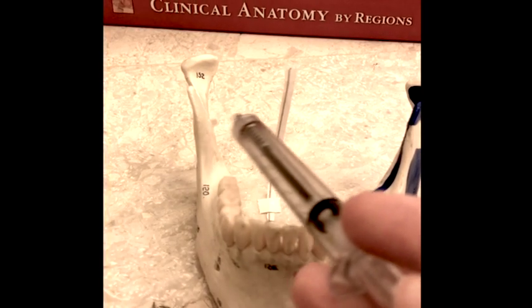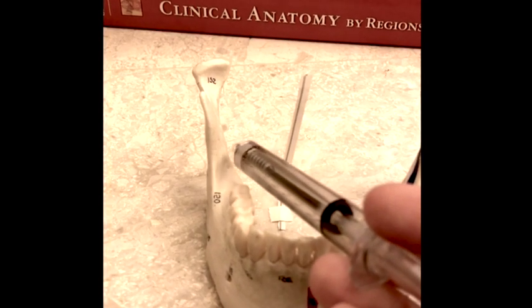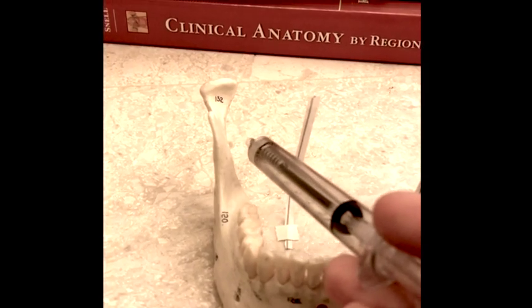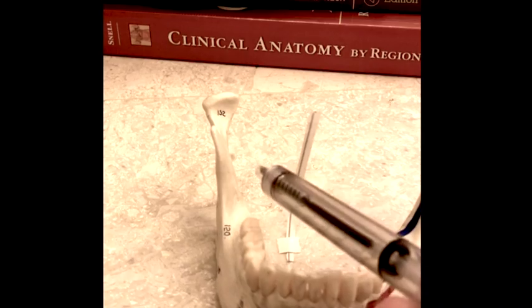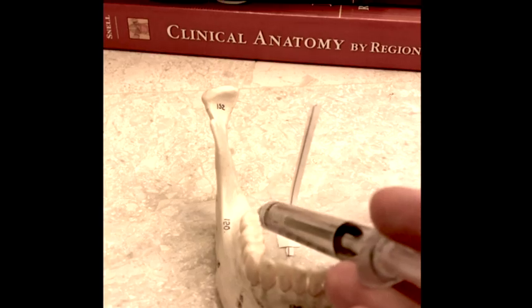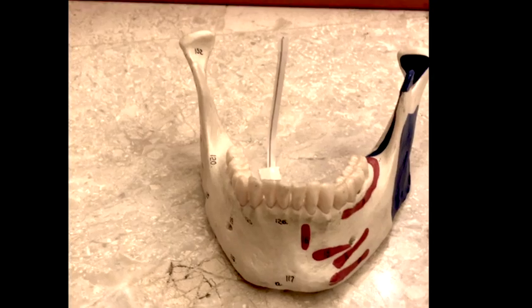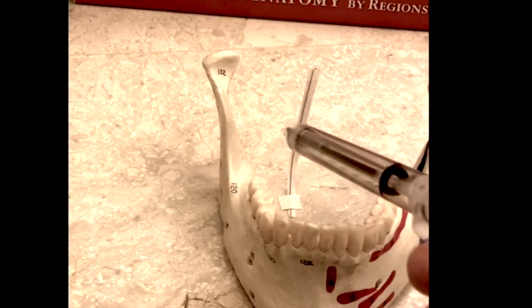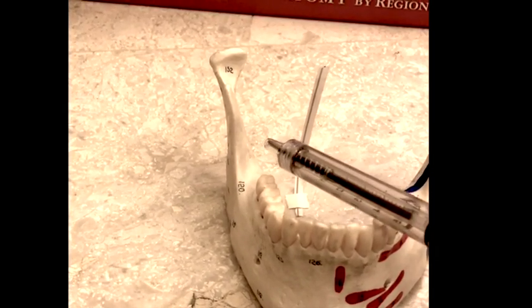Since the anteroposterior direction is determined from the coronoid notch to the pterygomandibular raphe, we divide this space into three thirds — first third, second third, and last third. The anteroposterior location should be two-thirds of this space, so it is here. I should then come from the opposite direction, over the second premolar.